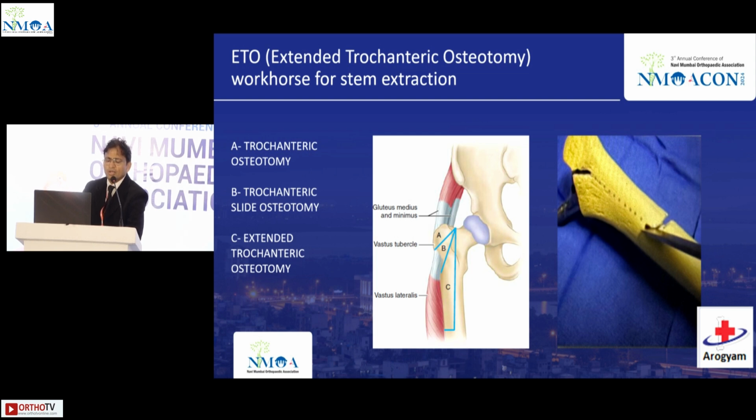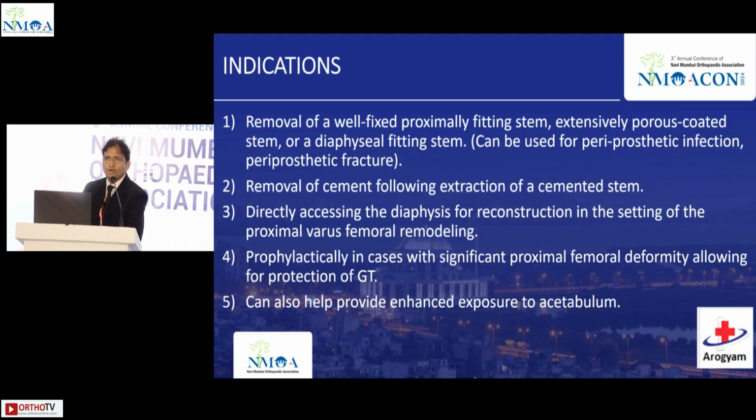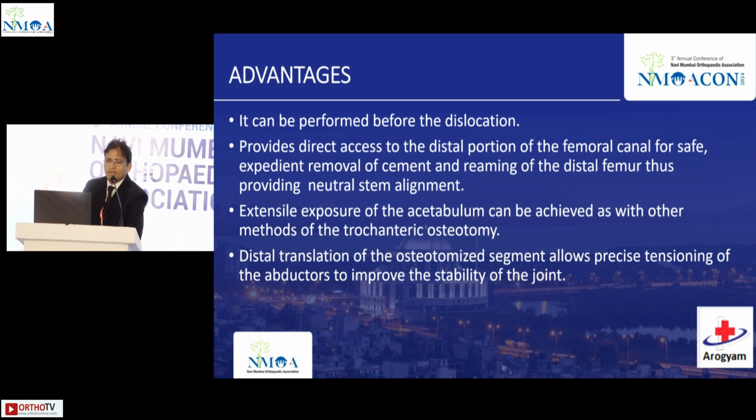So all in all, of the osteotomies, the most important, the most common workhorse is the extended trochanteric osteotomy. And this is indeed a boon for all revision surgeons. It has its own list of indications, but mostly it should be preferred where there is a well-fixed uncemented stem, or there is a varus remodeling, or there is a proximal femoral deformity and thinning of cortices. It has many advantages. You can have a good view of the acetabulum, and you can have a good view of the cement to be removed.